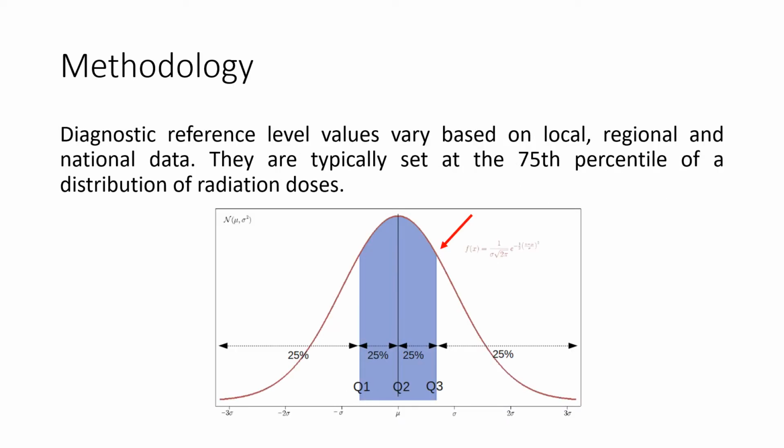Diagnostic reference levels give us information about the usual radiation dose delivered in diagnostic procedures, depending on the body part examined. These levels may be local, regional, or national, and are represented by the third quartile of the dose distribution for a body part location and image modality.